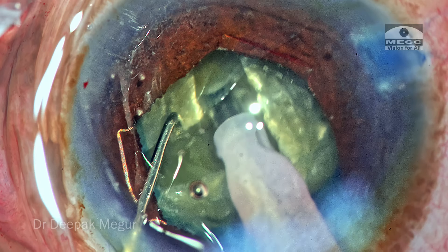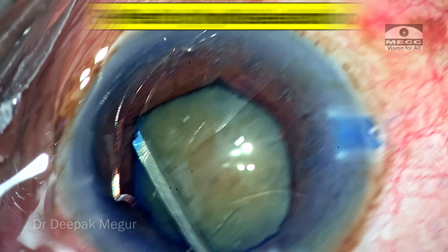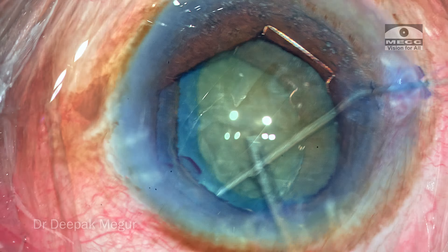This is the first-day postoperative picture. The cornea is clear and wound hydration near the incision has decreased significantly. To summarize: most challenging cases can be managed well if we spend time planning ahead. We anticipated the problematic pupil and generalized zonular laxity, ensured critical steps like rhexis and hydrodissection were precise, and inserted the CTR early to add stability to the bag so zonular laxity did not worsen during nucleus management. Technique of nucleus division is the surgeon's choice, but sculpting with the right technique does not worsen zonular laxity.